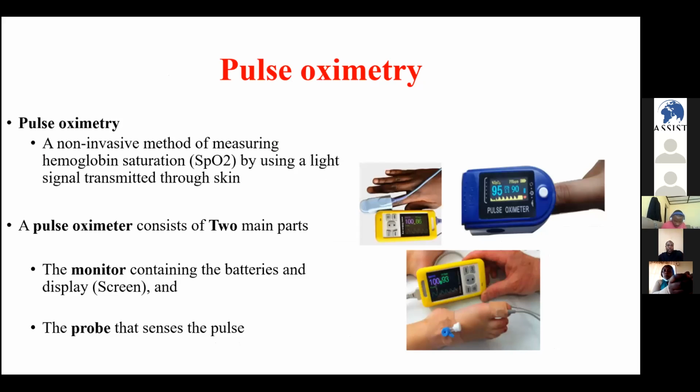On this slide, you are seeing the different pulse oximeter devices we use to detect hypoxemia.